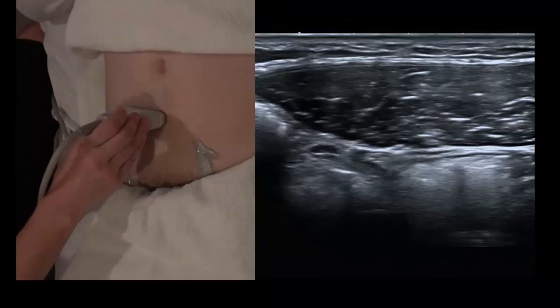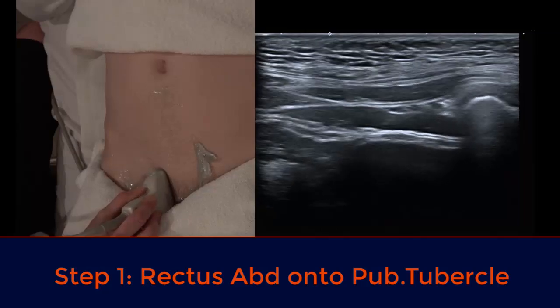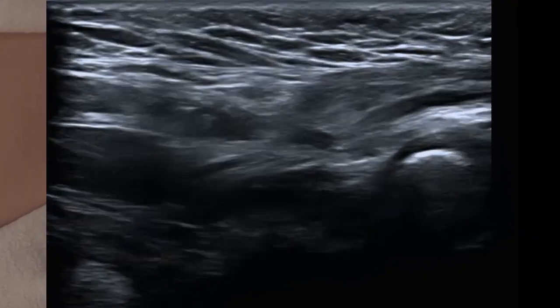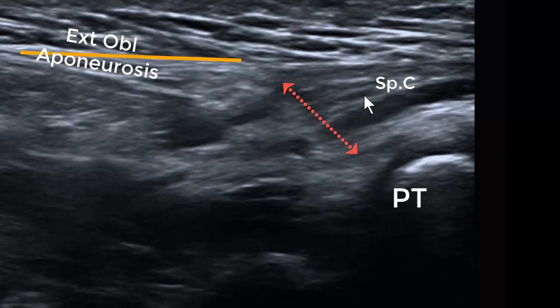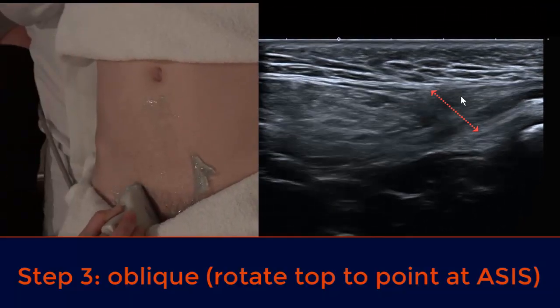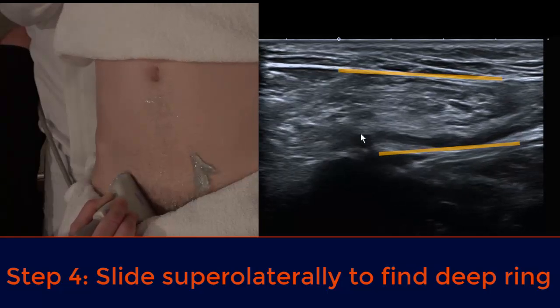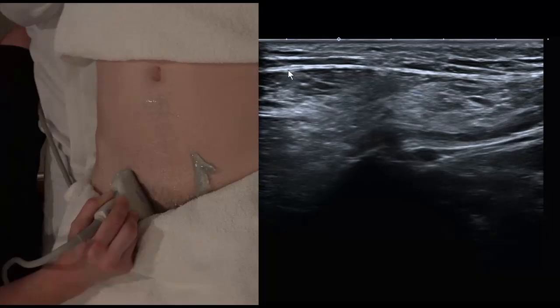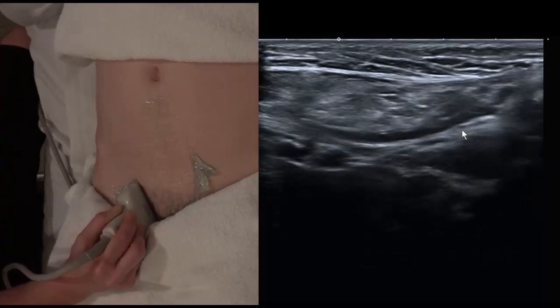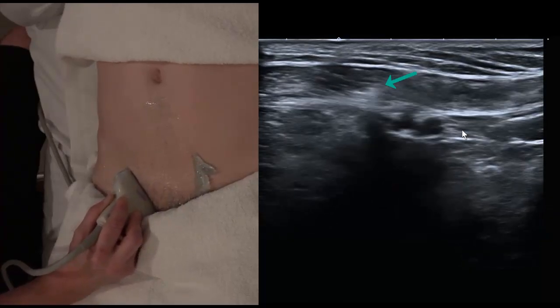Let's run over those steps. Run down the rectus abdominis and find the pubic tubercle. Move maybe five millimetres lateral, taking the pressure off to find a little opening in that echogenic aponeurosis — there it is, a little opening with some veins. This is our spermatic cord and the superficial ring. Now rotate the probe into oblique, identify the posterior wall of the canal, and follow those pampiniform veins up past the little epigastric vessel, looking for the triangular internal oblique. With those parallel white lines visible, compress and see what happens — the contents slip back into the abdomen, which is not typical of a spermatic cord. It's got to be a little hernial sac.